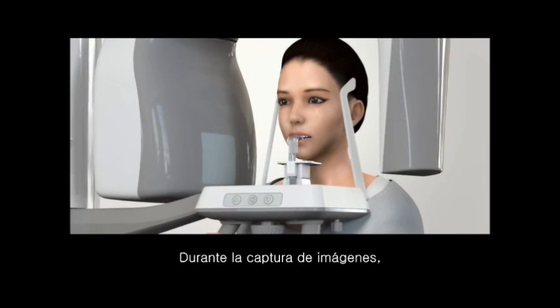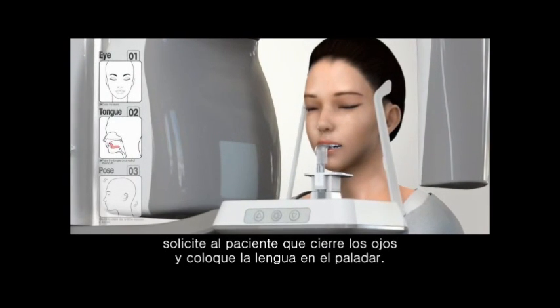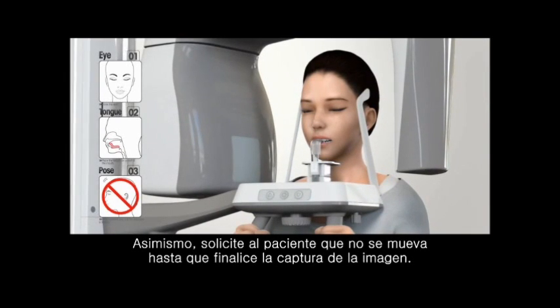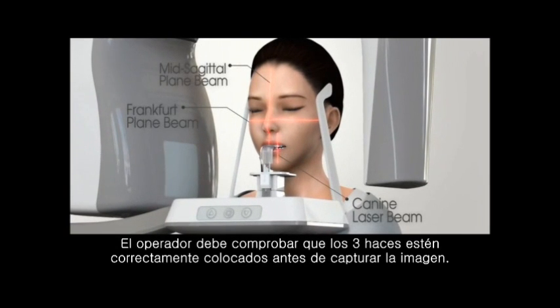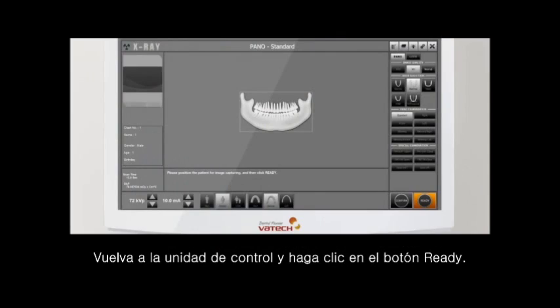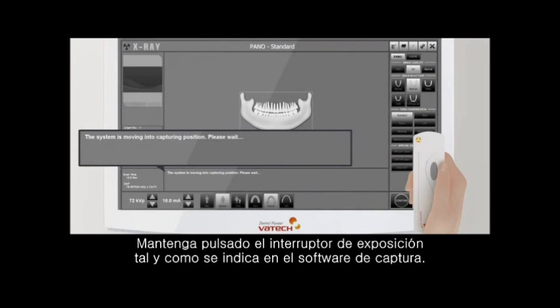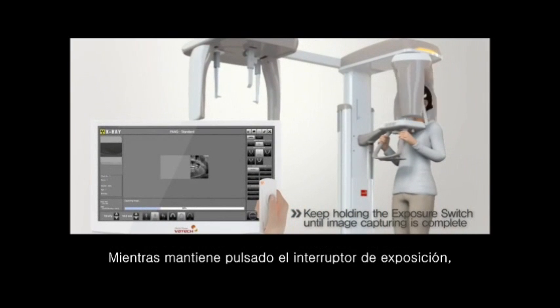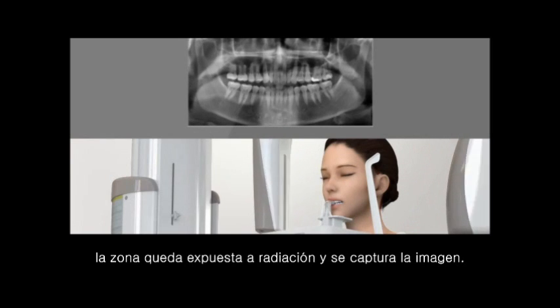During image capturing, ask the patient to close the eyes and place the tongue to the hard palate. Also, instruct the patient not to move until the image capturing is completed. The operator should confirm 3 beams are placed appropriately before capturing the image. Go back to the control unit and click the Ready button. Press and hold the exposure switch as guided in the capture software. While the exposure switch is held, radiation is exposed and the images are taken.